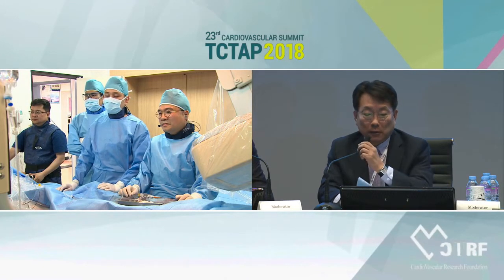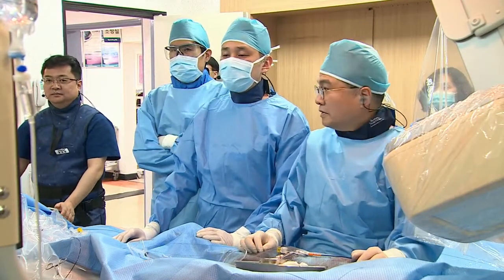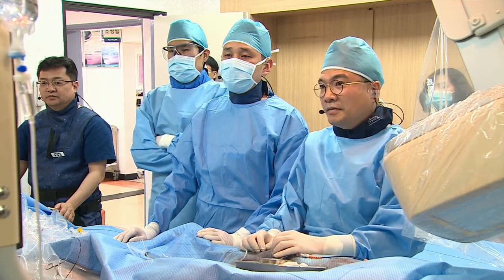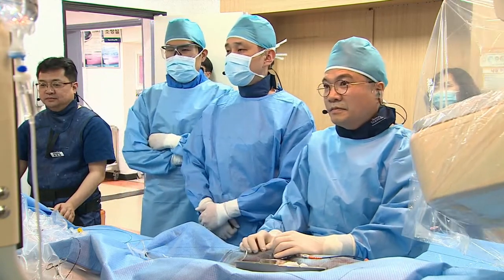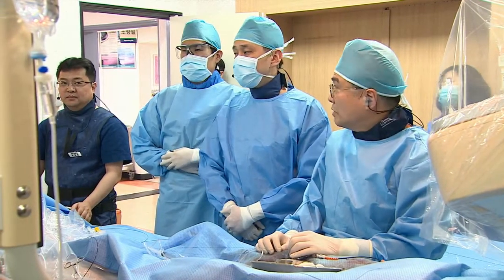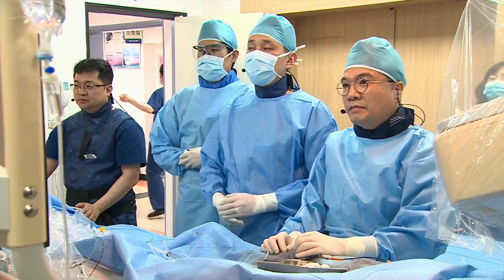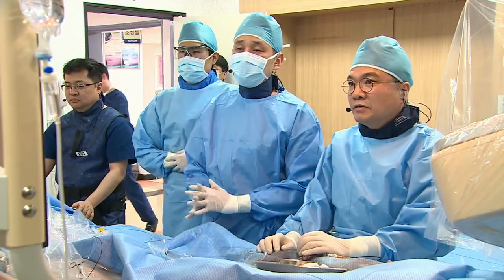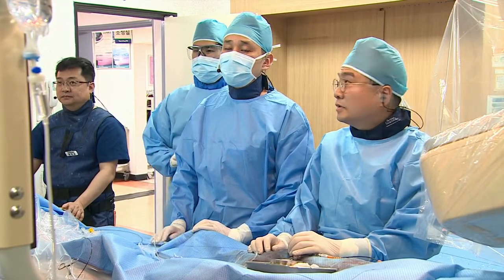So we'll just start, Dr. An. Yes, welcome to my case. Before starting my case, I'd like to introduce my team. Beside me is Min-Cheol Kim, and another person is Gwangju Min, and today's IVUS commentator is Professor Hong. Today we prepared a left main bifurcation case. Professor Kim will present our case, please.